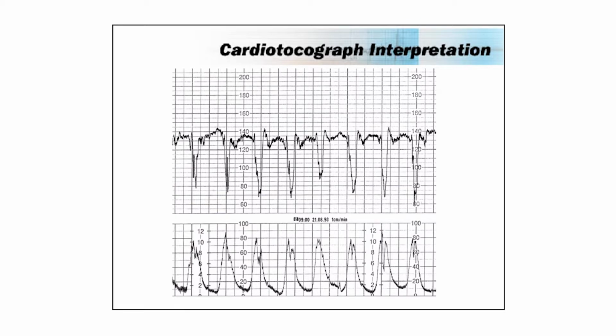If I said to you, this is a first-time mother, the descent is -2. She has begun involuntary pushing, and the head is slightly deflexed. You'll be much more concerned here. You're going to have to take a decision to do something in this regard. You can't afford to be waiting the next anticipated 1 hour plus. Yeah? So you take all the other features into account.